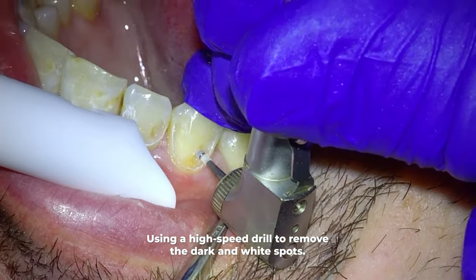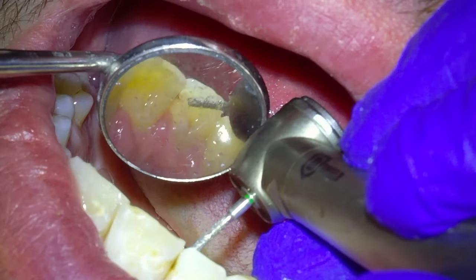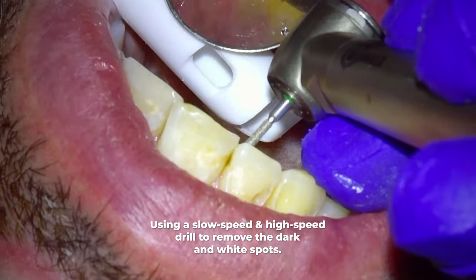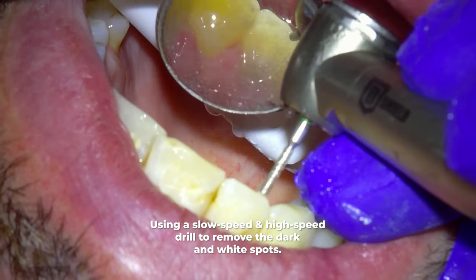Before removing all the underlying discoloration, I want to pause here to show you the last dark spot I want to remove. When looking at it from the back side through my mirror, you can see this dark shadow which shows us there is decay here. For cosmetic reasons it is best to uncover the decay from the back side of the tooth and not the front side. As we drill into it you can see we have exposed the dark decay in the mirror.